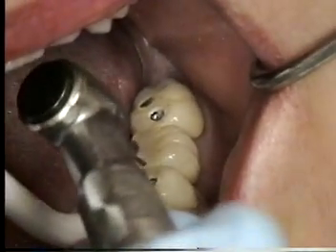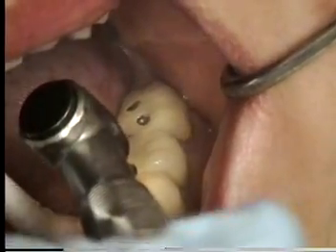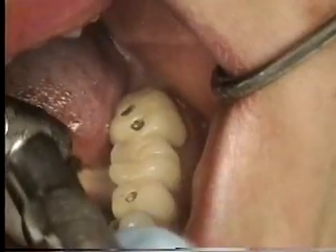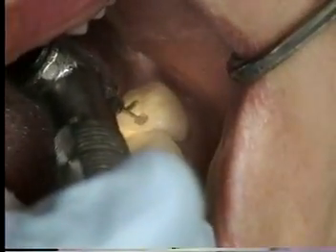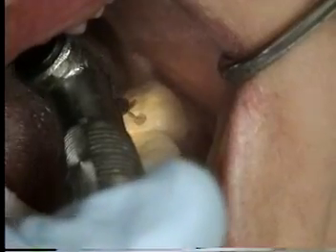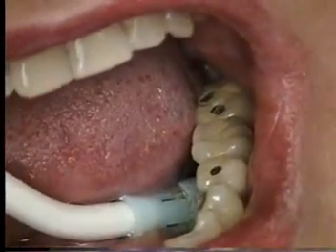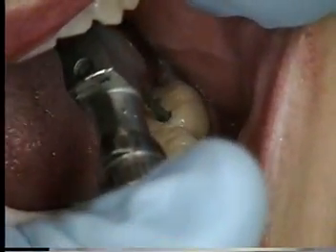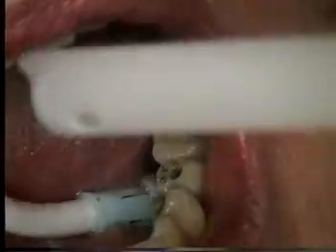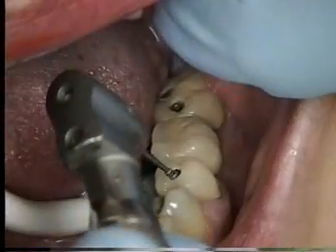Then I'll turn the water back on and penetrate through the metal. We have apparently a non-precious alloy here, but I got through and it's pretty thin. Now with my metal lift burr, let's see if we can get a precision channel. I'll go down underneath the metal just slightly and remove a little bit of dentin so I don't catch any dentin threads.